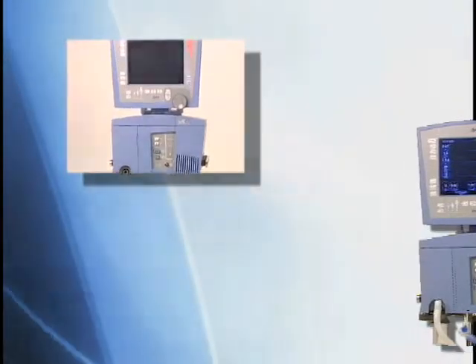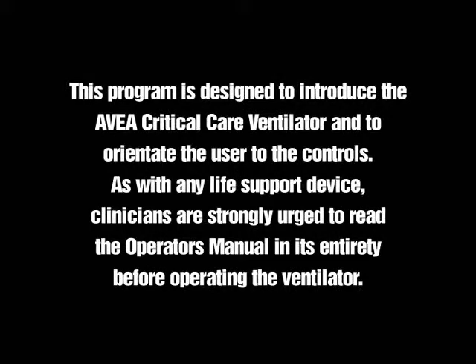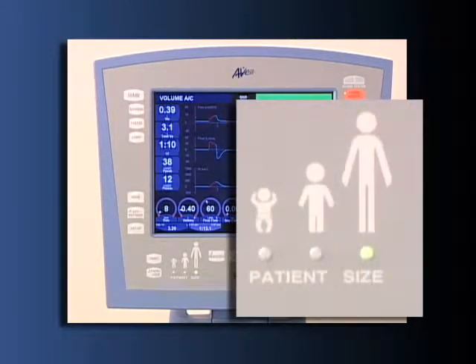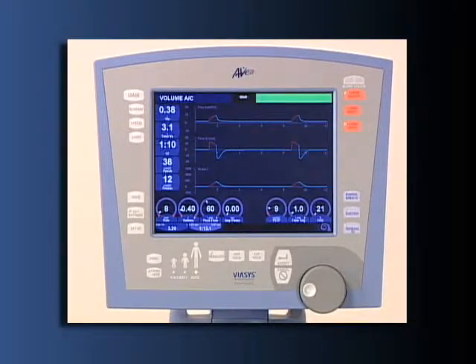Welcome to the AVEA Ventilation System Training Series. This program is designed to introduce the AVEA Critical Care Ventilator and to orientate the user to the controls. As with any life support device, clinicians are strongly urged to read the operator's manual in its entirety before operating the ventilator. The AVEA Ventilator is designed to treat ventilation disorders in all patient populations, from the smallest neonate to the largest adult. Its revolutionary design incorporates intelligent ventilation with simplicity of operation.